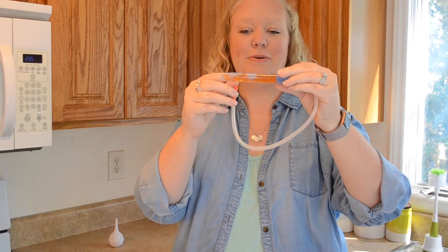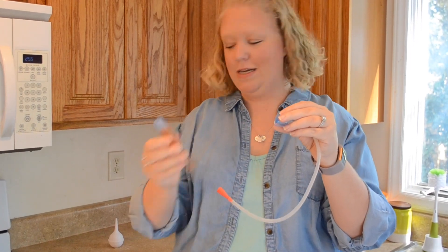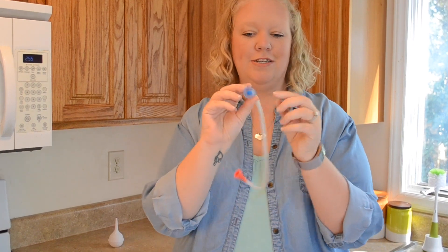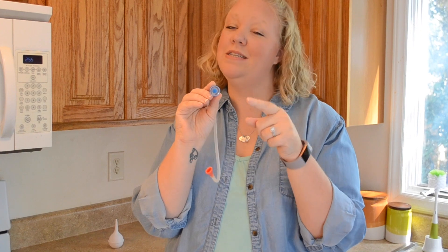The most amazing thing is that no matter how many boogies you suck into this thing, this little filter in here is the key that is going to keep those germs from your little one's nose out of your mouth. That's the key right there to preventing the grossness.